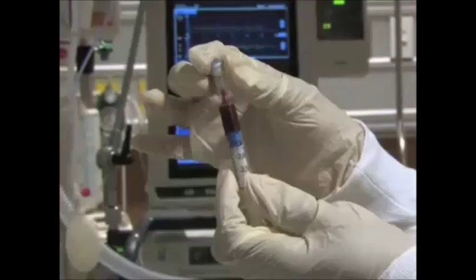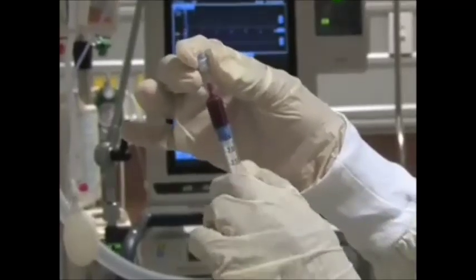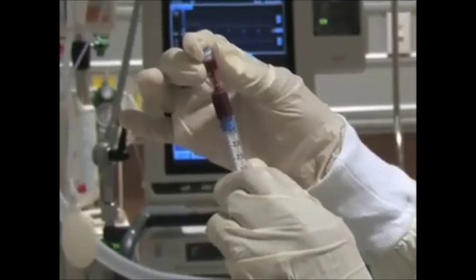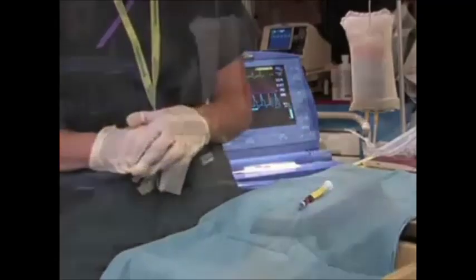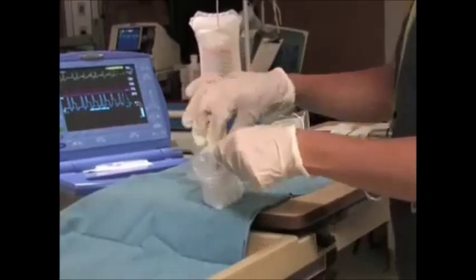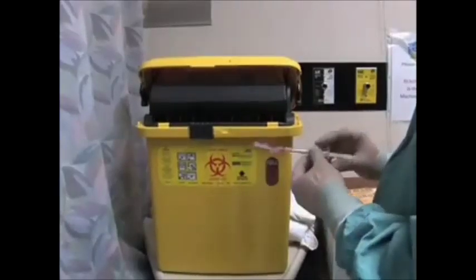Attach the heparin-containing cap and, while holding the cap in place, push the plunger of the syringe to ensure the blood encounters the heparin. This will prevent the blood from clotting. Ensure that the syringe is labeled with the patient's name and unit number. Place the entire syringe in the bag of ice if transport to the lab is required. After pressure has been applied to the puncture site for 5 minutes, affix the gauze with some tape. Dispose of all sharps in the designated sharps containers.